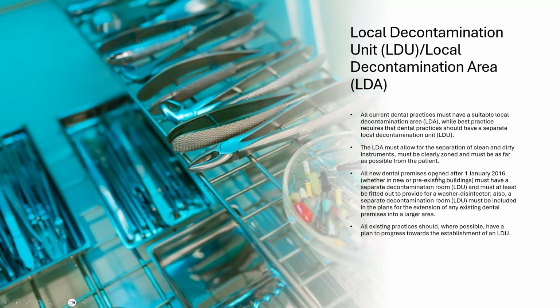All new dental premises opened after January 1st, 2016, whether in new or pre-existing buildings, must have a separate decontamination room or LDU and must at least be fitted out to provide for a washer disinfector. Also, a separate decontamination room must be included in the plans for the extension of any existing dental premises into a larger area. All existing practices should, where possible, have a plan to progress towards the establishment of an LDU.